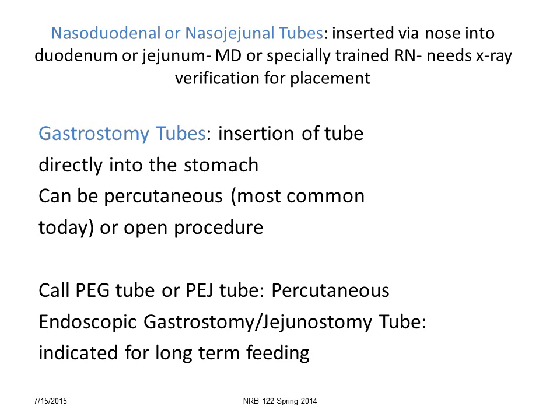Years ago it required surgical placement. Now these are inserted percutaneously in an endoscopy suite. And I know some of you last semester when you went to the OR had the opportunity to see these tubes being inserted. It's a tube inserted directly into the stomach, and it's used for long-term feeding.